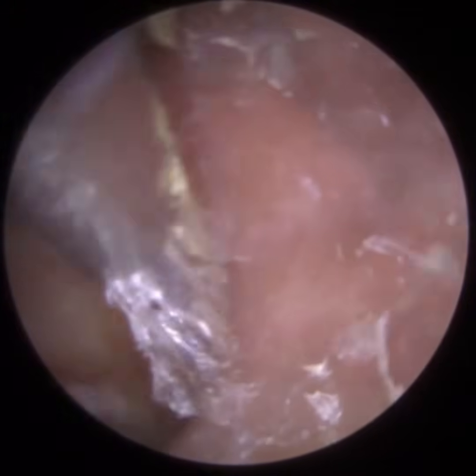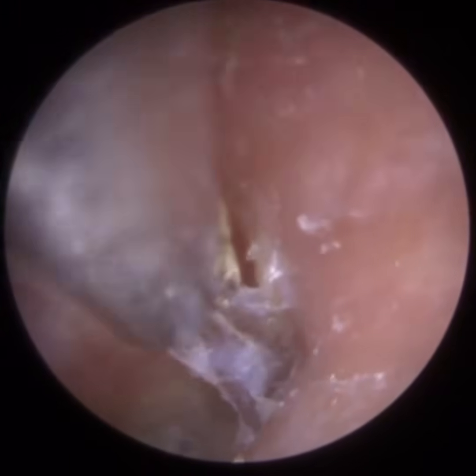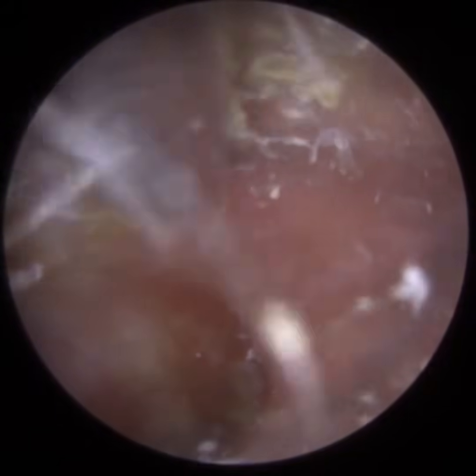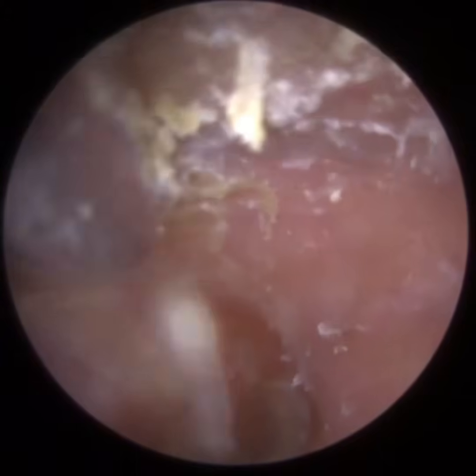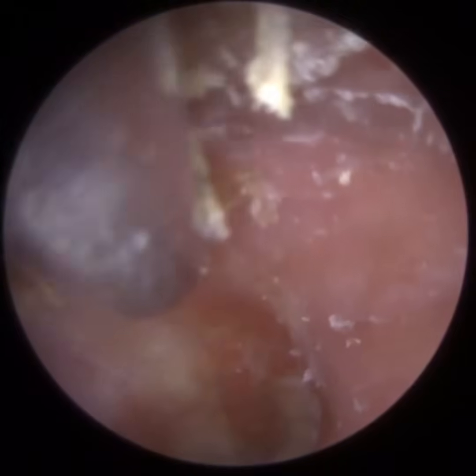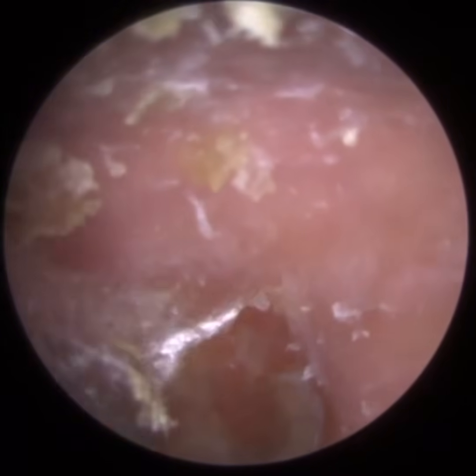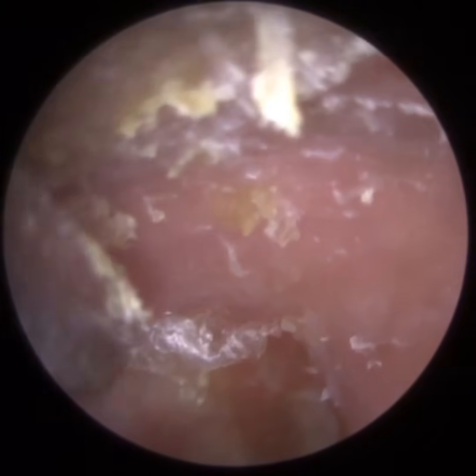Just peeling this forwards all the way to immediately towards the eardrum again. So slowly you can see what we've done, layer by layer. We're removing this dead skin, and we're going to see the flesh of the ear canal now. So again, we're just at the roof of the ear canal. The skin that I'm on now is still on the eardrum.